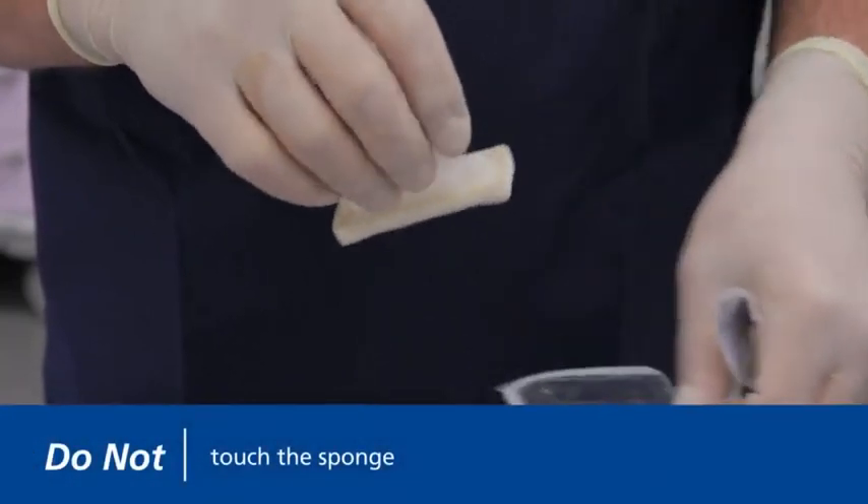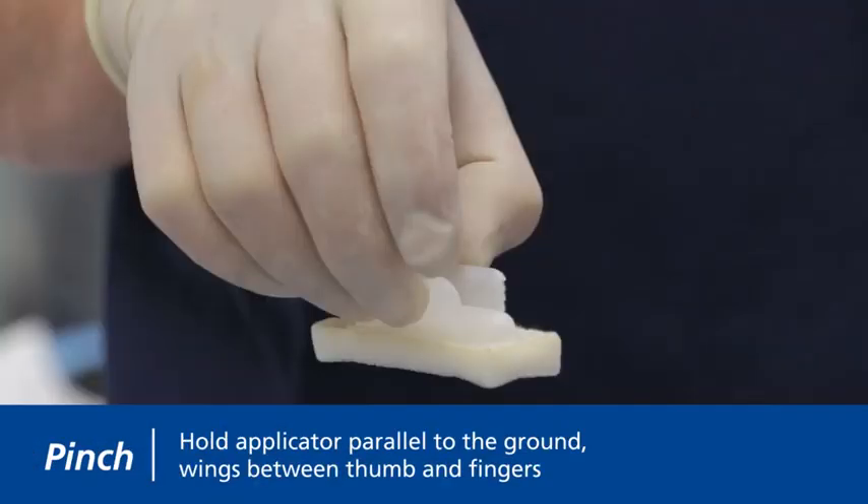Do not touch the sponge. Hold the FREP applicator with the sponge in a horizontal position parallel to the ground with the wings between your thumb and fingers as shown.